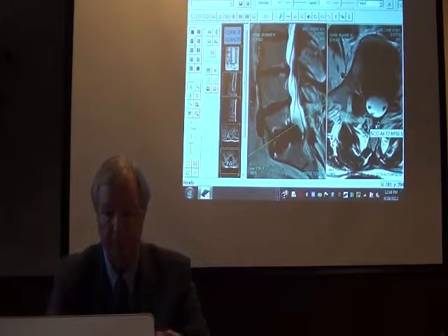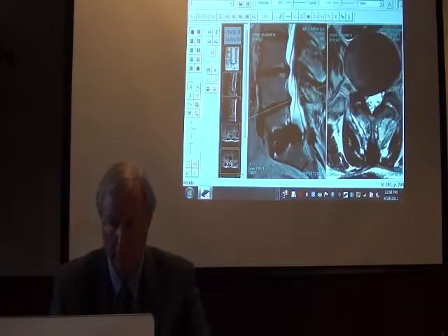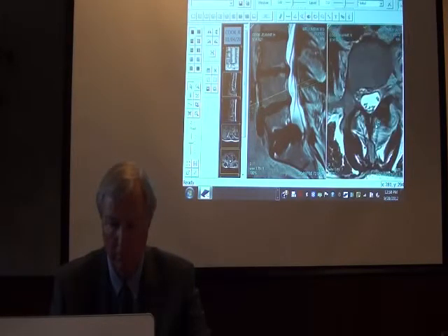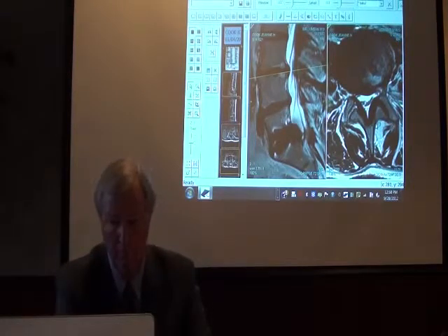Okay. And in making the comparisons between this particular MRI scan, you state that there is a significant change between what you're seeing here in January 2010 vis-a-vis the previous MRI scan. Is that correct? Yes. Okay. And specifically as we're looking at the L3-4 and L4-5 levels.